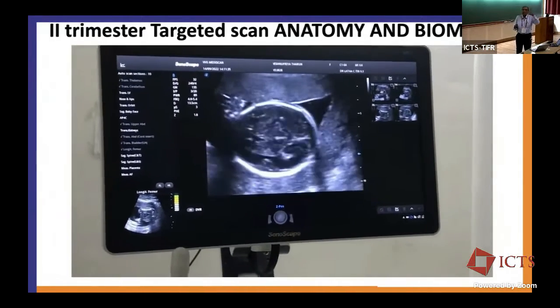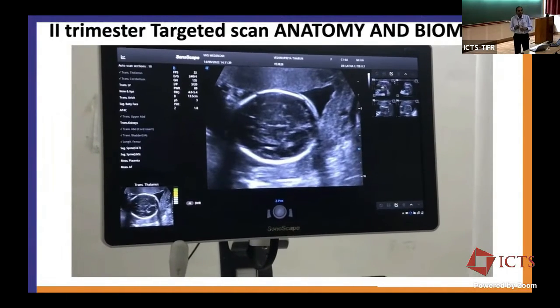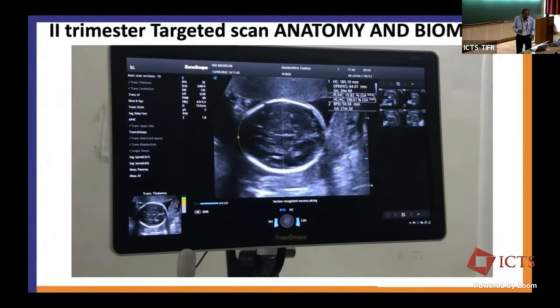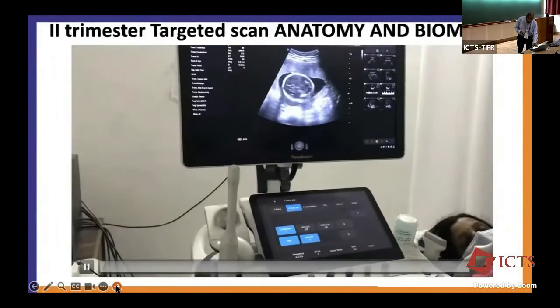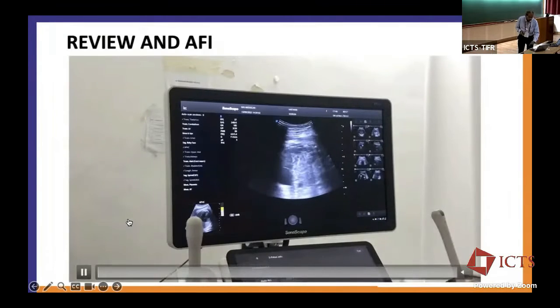And I find that 6 images have already been taken. I need to take another 7 or 8. I complete that. So it's currently available and operational, which I think is a very, very good improvement.